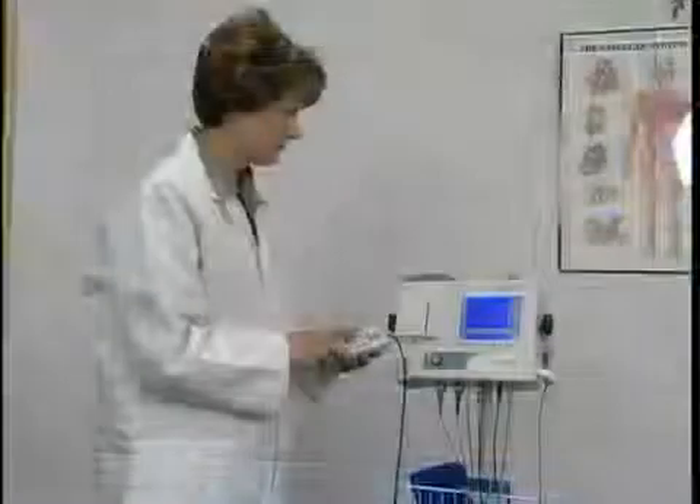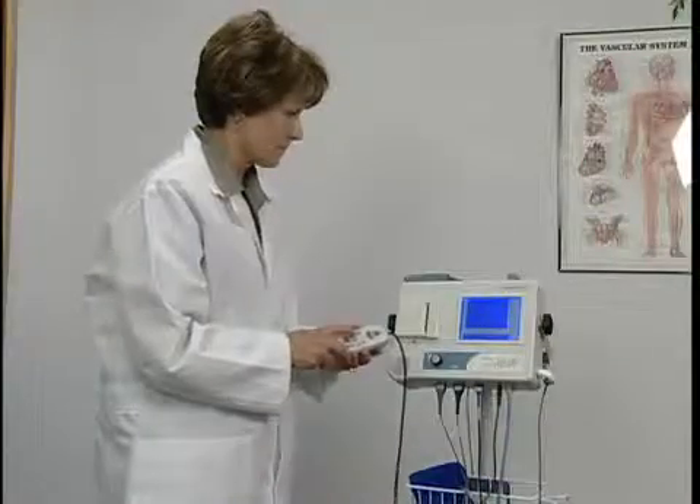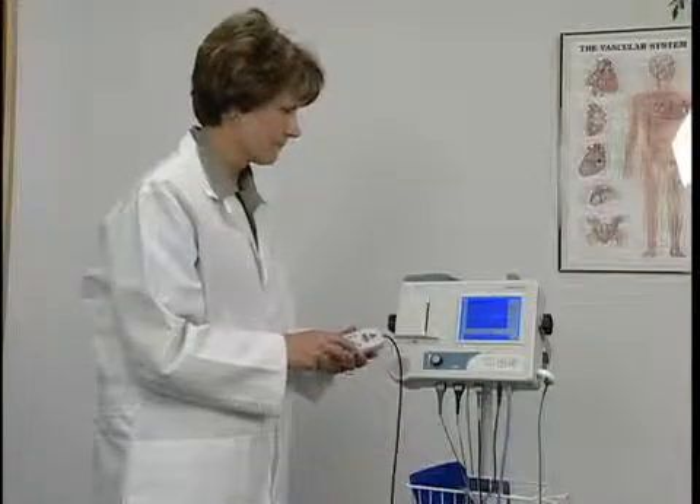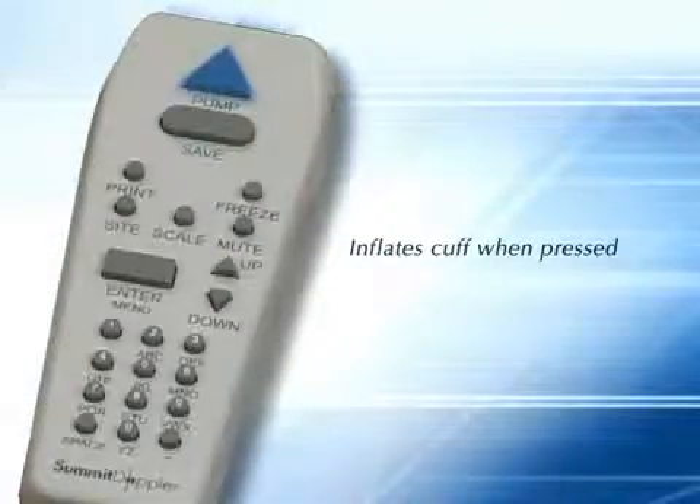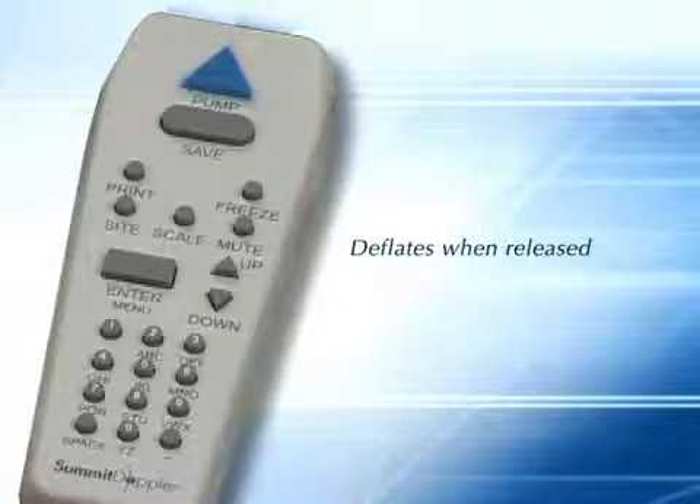For a different order, use the site key on the handheld controller to move to the desired site. On the controller, there are several keys for navigation. While pressed, the pump key inflates the cuff. When released, the cuff automatically deflates at a rate of 2 to 3 millimeters of mercury per second.